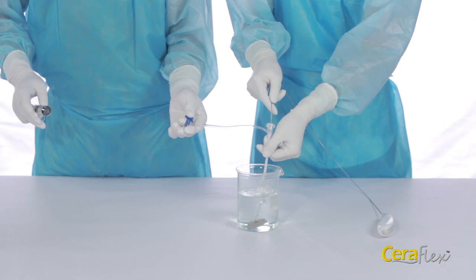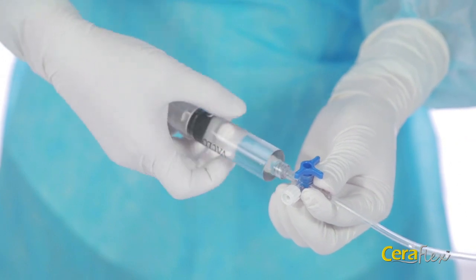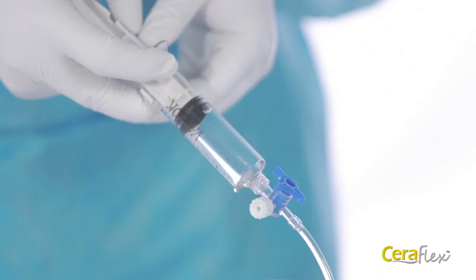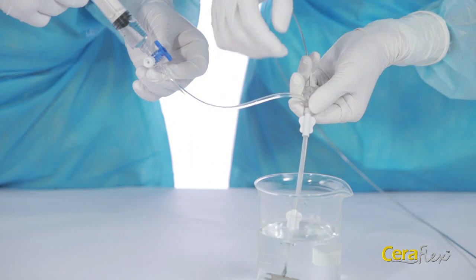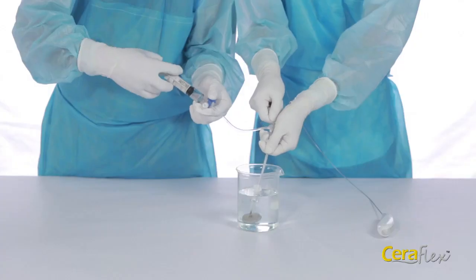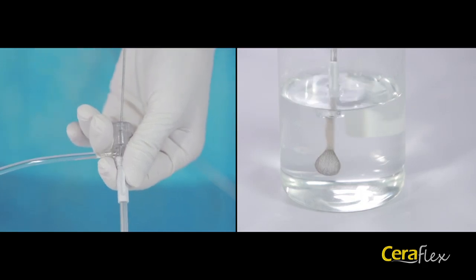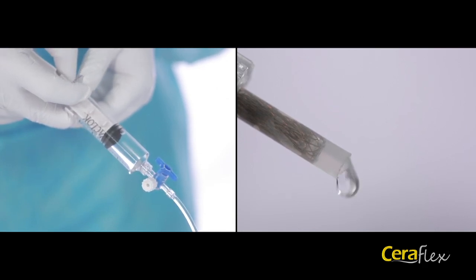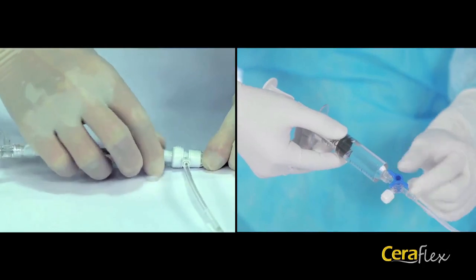Screw the seal cover of the hemostatic valve clockwise. Immerse the occluder into the saline solution and gently shake the occluder. Flush the loader, and flick or tap the loader as needed to move any air bubbles. Ensure the sheath, dilator, and occluder are all adequately flushed to eliminate air. Gently insert the occluder into the hemostatic valve of the SteerEase delivery sheath.